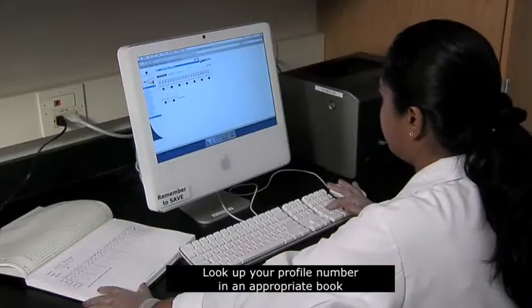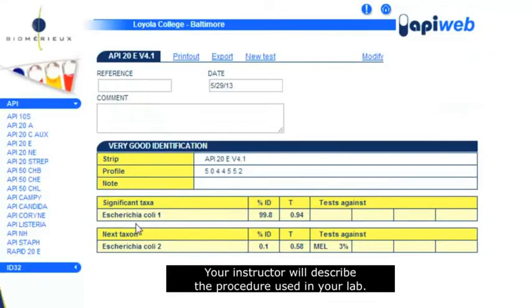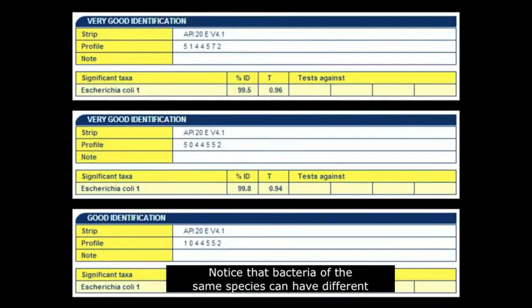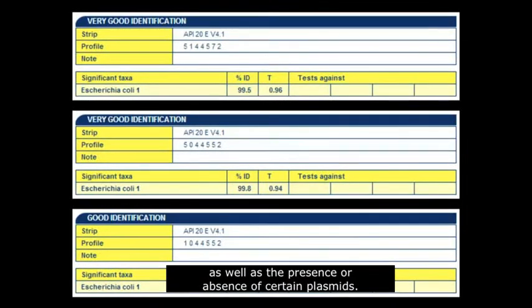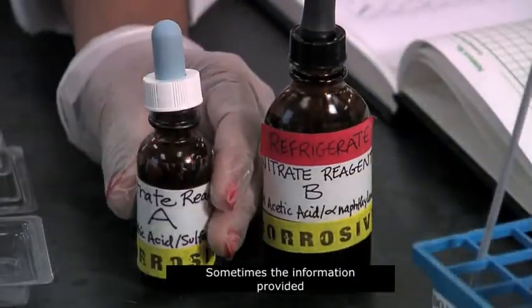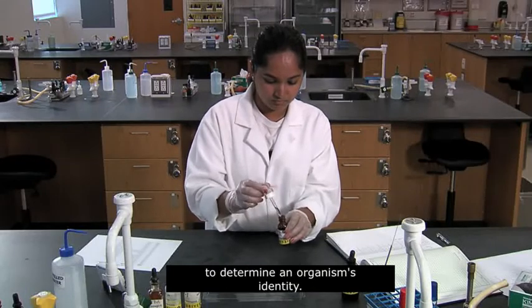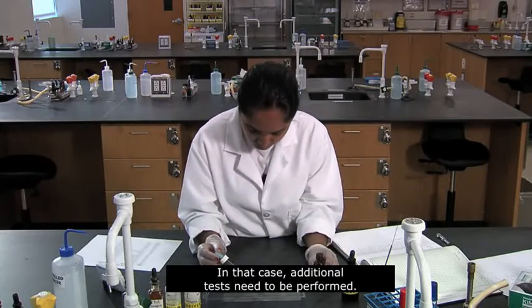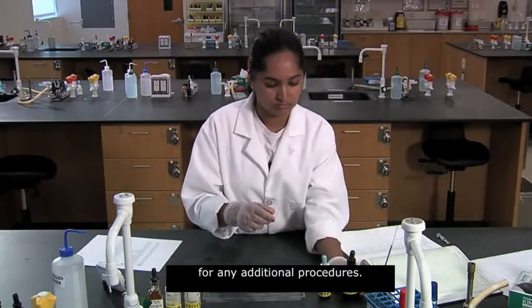Look up your profile number in an appropriate book or computer database to identify your bacterial species. Your instructor will describe the procedure used in your lab. Notice that bacteria of the same species can have different profile numbers. This natural diversity within species can be due to mutations, as well as the presence or absence of certain plasmids. Sometimes the information provided by the API-20E strip will be insufficient to determine an organism's identity. In that case, additional tests need to be performed. Follow your instructor's directions for any additional procedures.